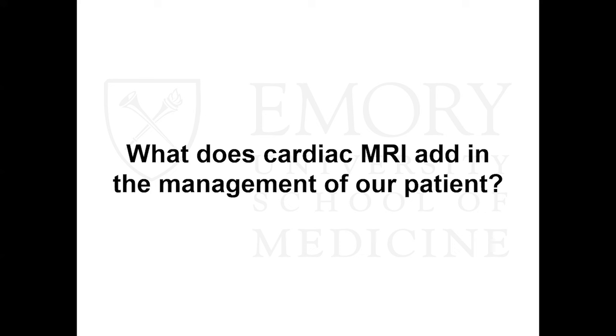And so whenever I got called for this admission, the first question I really had was, why did we get this cardiac MRI? Taking a look at all the imaging and other data that we had up to this point, we had a pretty good diagnosis of constrictive pericarditis. We had pretty solid echo findings. We had invasive hemodynamic assessment.